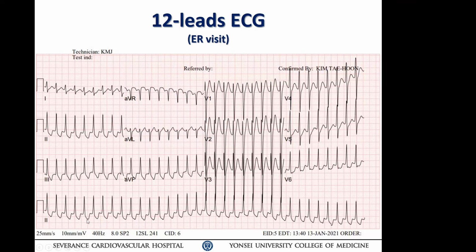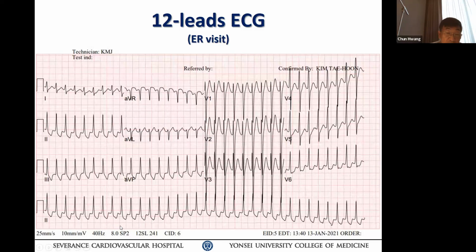봤어? Right. It's the same concept. During the T wave repolarization of a QRS complex, you should not have any deformity whatsoever. 그래서 중간에 보면 deformity가 더 깨끗하게 잘 보이는 거, 그게 분명히 there is a retrograde P wave. There, right there. Yes, good. So this is consistent with the relatively longer RP tachycardia, which is possible for AVRT, right? Okay, 갑시다. Anything else?